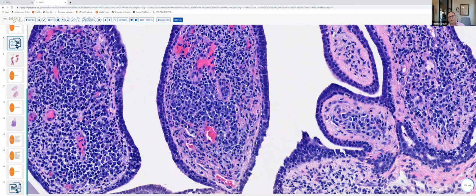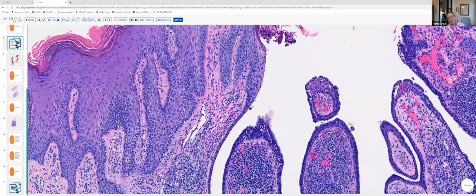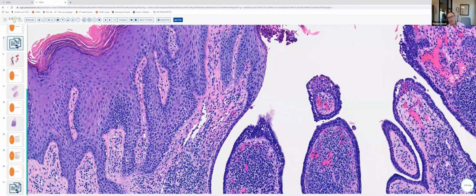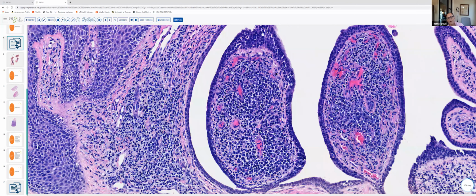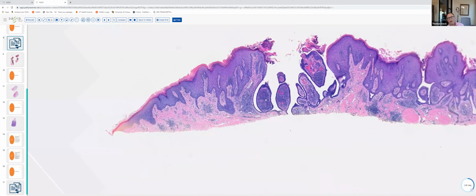Syringocystadenoma papilliferum differs from Hidradenoma papilliferum in that, unlike Hidradenoma papilliferums, syringocystadenoma papilliferums are attached to the overlying epidermis. And so generally one can see a transition from stratified squamous epithelium of the epidermis to the more glandular epithelium. The second big difference comes from looking at that fibrous core, the mesenchymal tissue in the center portion of the papillary projections. It typically is stuffed full of lymphocytes and numerous plasma cells in a syringocystadenoma papilliferum. So generally, one can distinguish these 2 tumors quite readily.